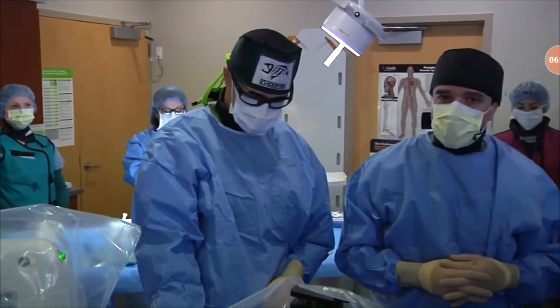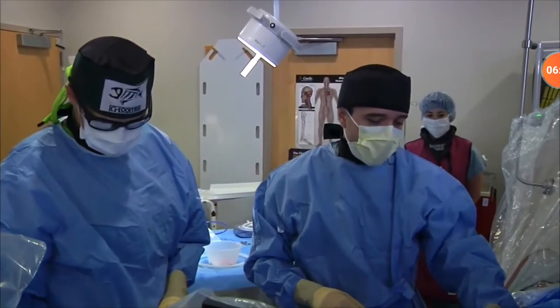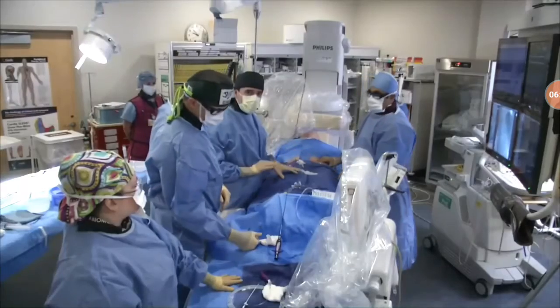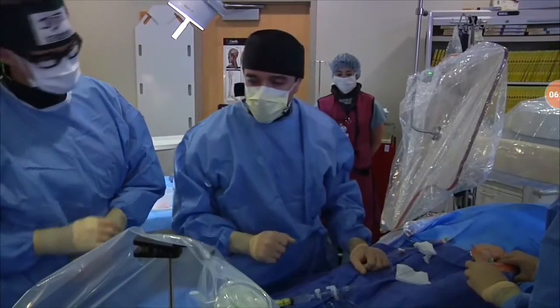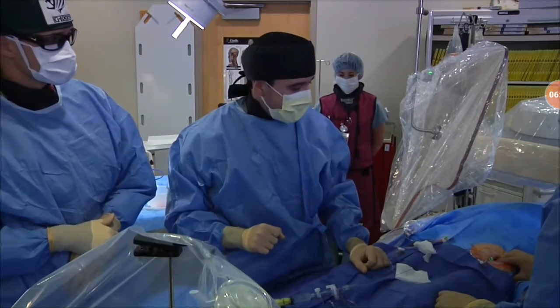It's a great honor to have Yohei here during the case. And we hope this case is going to be very helpful, and I hope you guys enjoy this implantation of Evolut R. As you can see, we're in the cath lab. This is not a hybrid OR. So our patient is awake and very mildly sedated. And we gave, of course, local anesthesia bilaterally here and very mild sedation. So that's what we do for every single case, as long as it's a transfemoral case. And we're going to proceed.